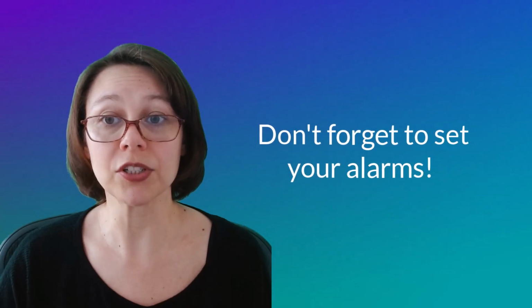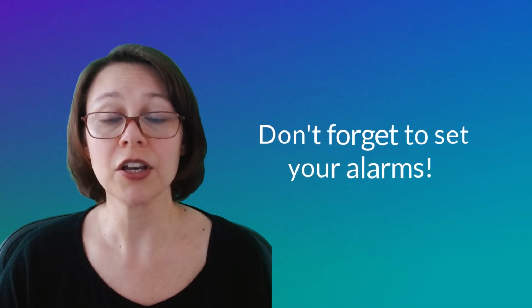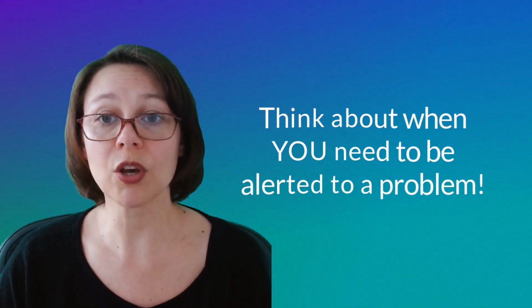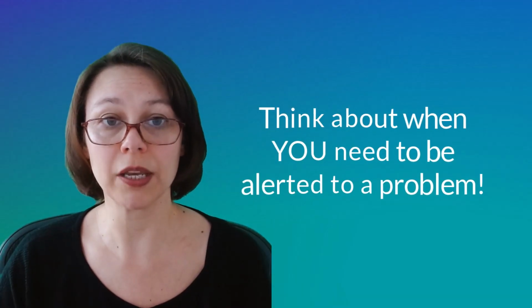Alarms are extremely important, and they require you to set them, just like your other ventilator settings, so don't forget them. They have default settings when you turn the ventilator on, but they are often way outside of what they should be. Alarms are there to tell you that there's been a change in the patient's breathing, so you need to make sure that they are set to a point where you are alerted when things go outside the bounds of where they should be.